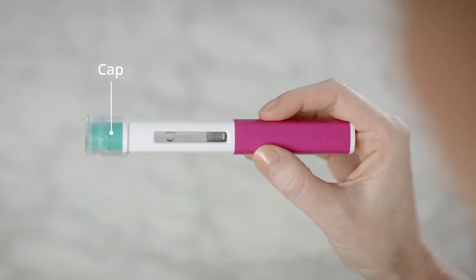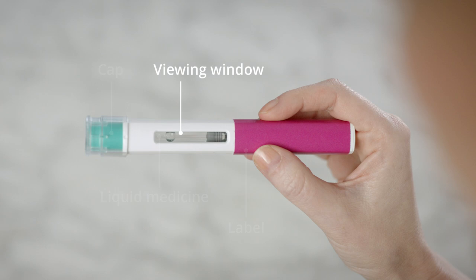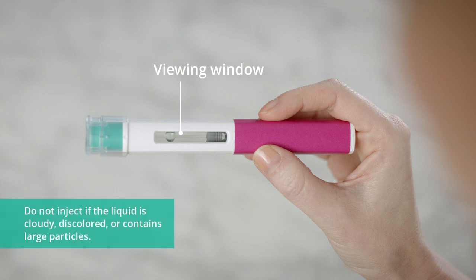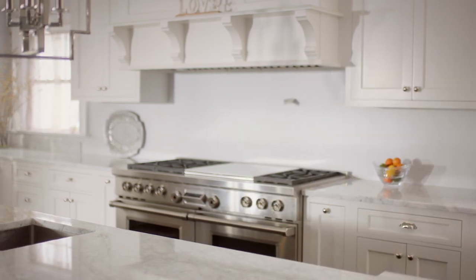You should know the different parts of the Fasenra pen. This will help you when it's time to inject. Check the liquid through the viewing window. It should be clear and colorless to slightly yellow, and may contain small white particles. You may also see small air bubbles in the liquid. Once you have everything you need, bring your supplies to a place where you're comfortable injecting.